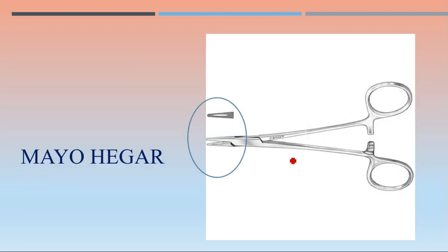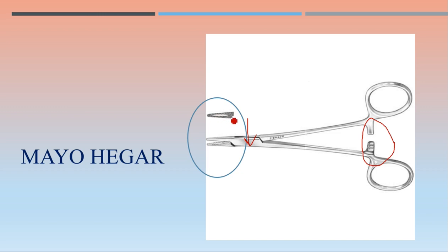Then the Mayo-Hegar needle holder — focus on the presence of lock, the fulcrum or joint, and the tip where you can see a depression or eye along with serrations on both jaws. This is the Mayo-Hegar needle holder.